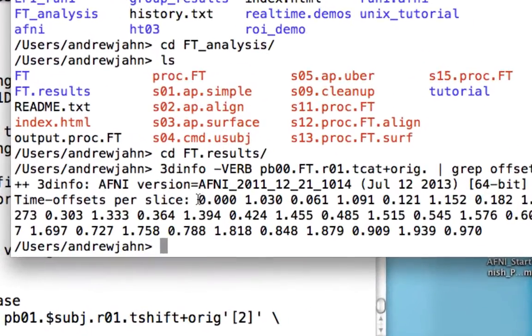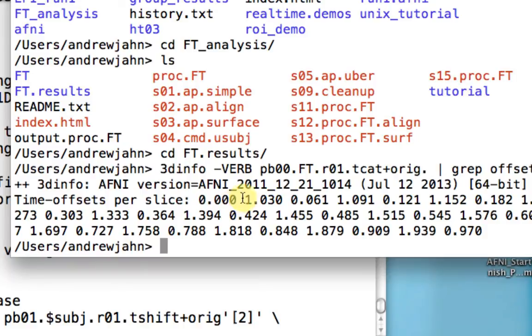What you'll see here is the timing that each slice is acquired at. So this is also known as interleaved ascending. So this is slice number one. It's acquired at obviously the very beginning of the TR. This is actually acquired 1.03 seconds into the volume acquisition, then 0.061. So what you see is they're interleaved.